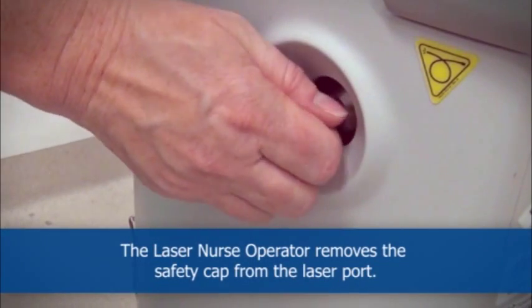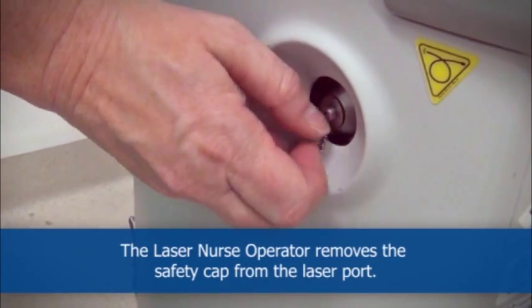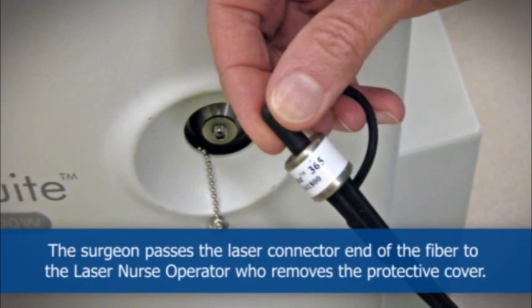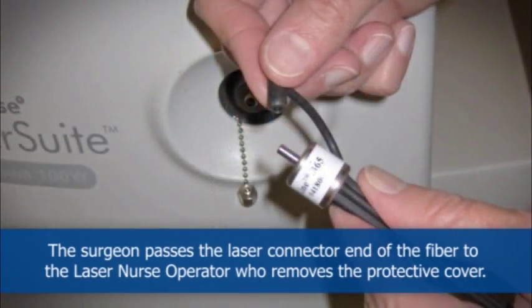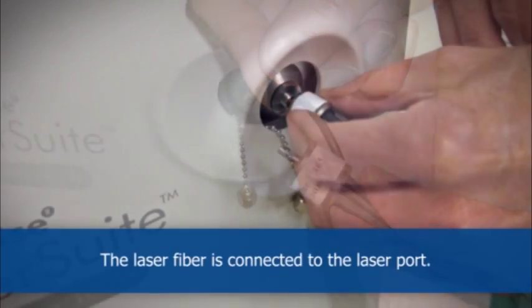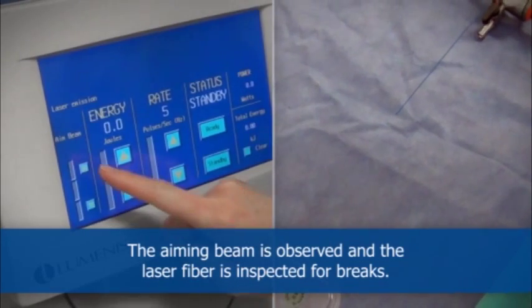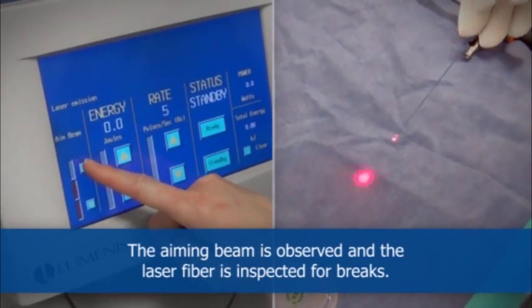The laser nurse operator removes the safety cap from the laser port. The surgeon passes the laser connector end of the fiber to the laser nurse operator, who removes the protective cover. The laser fiber is connected to the laser port. The aiming beam is observed and the laser fiber is inspected for breaks.